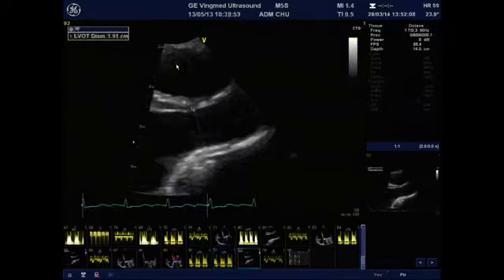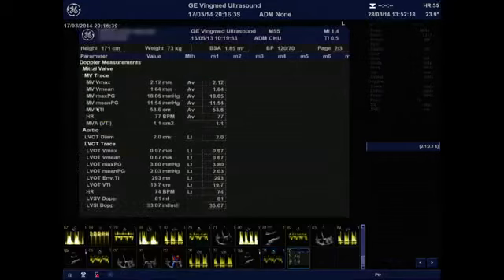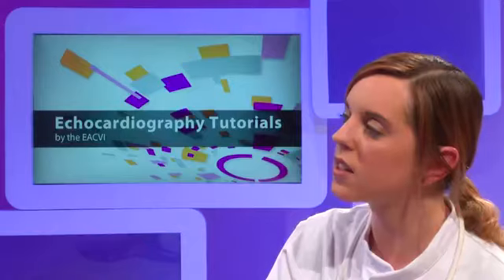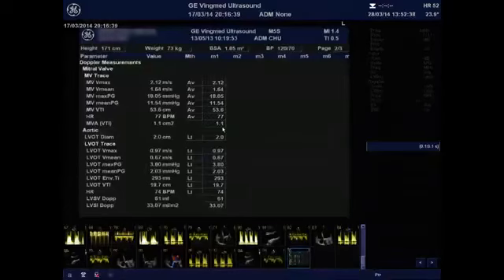And if you use the continuity equation with the left ventricular outflow tract diameter and the left ventricular outflow tract velocity time integral, you can calculate the mitral valve area of 1.1, and the reference value for that kind of prosthesis is 1.3. So it's in the normal range for that kind of prosthesis. So now what you need to assess is the indexed mitral valve area.